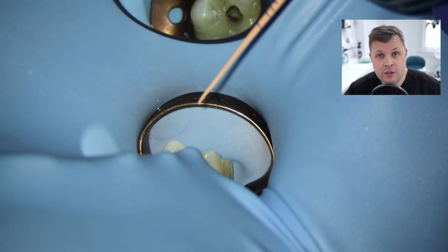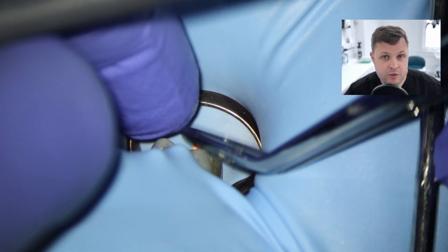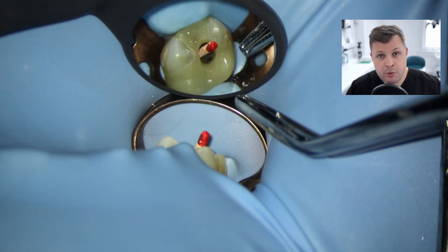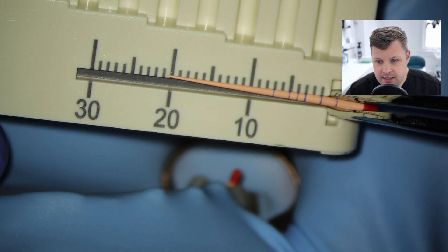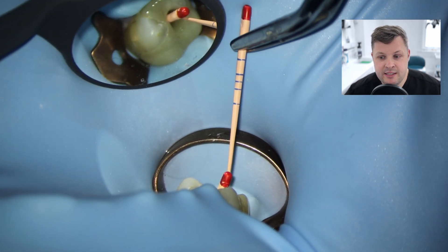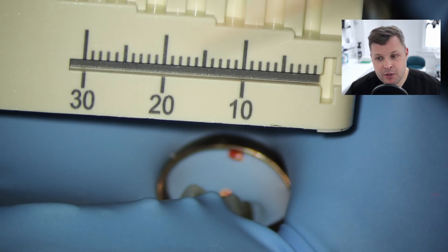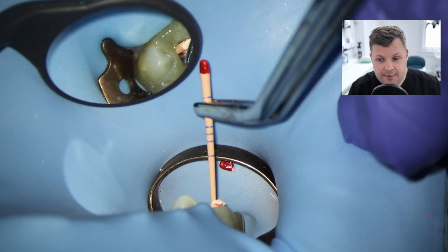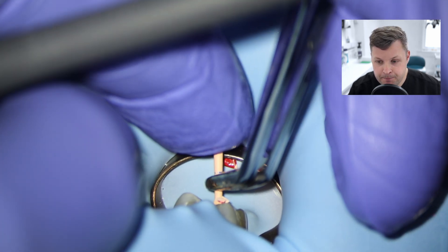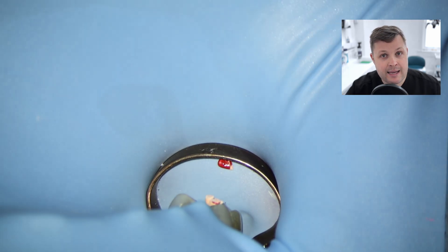It's just the same protocol for the other two canals. The other two canals didn't need to be gauged because when we pushed them to length, we felt for tug-back and it fits nicely. You'll notice that as I fit these cones to length, I like to snip the ends of the GPs off. I like to do this because sometimes, especially when you've got a lot of excess sticking up, when you go for the cone fit radiograph, these GP cones can be sort of pulled out. That's why I like to chop them off. Also when I go for the obturation, it gives me a really obvious mark to which these GP cones should be fitting as I push them to length with the sealer.